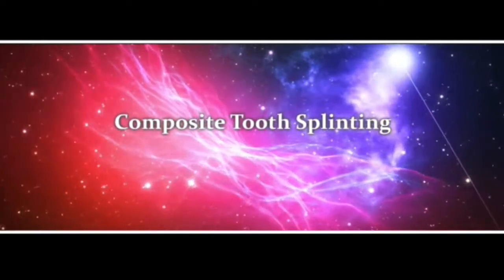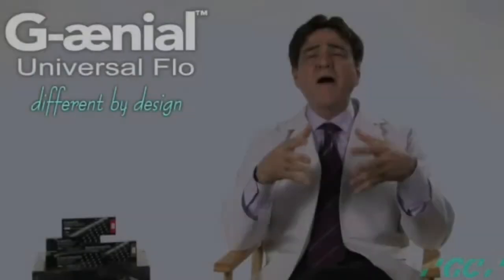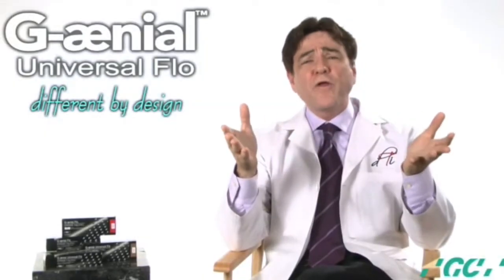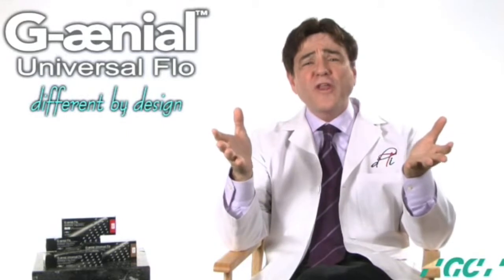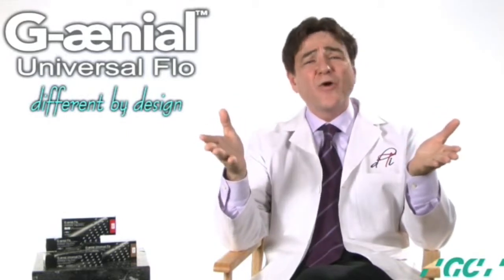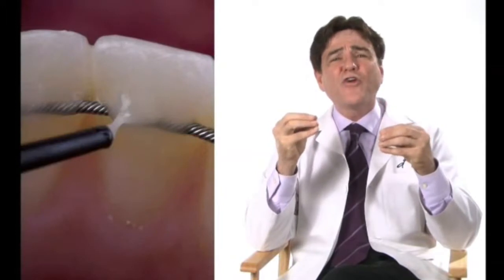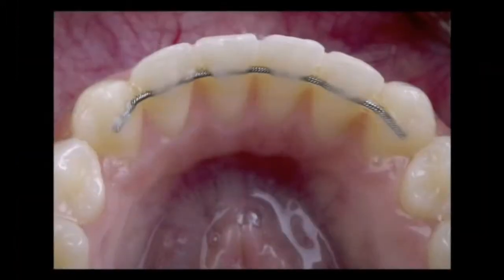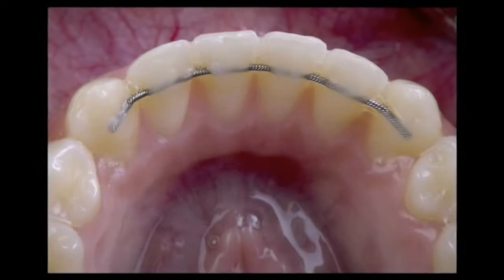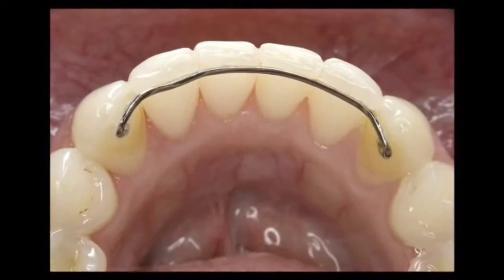For composite tooth splinting. Composite tooth splinting has widespread use in dentistry for stabilization and immobilization of teeth, for orthodontics, periodontics, oral surgery, pedodontics, and general dentistry. It provides tooth fixation through application of a light-cured flowable or chemically cured composite material to acid-etched enamel surfaces in combination with flexible stainless steel wire, orthodontic brackets, or fiber-reinforced ribbon.